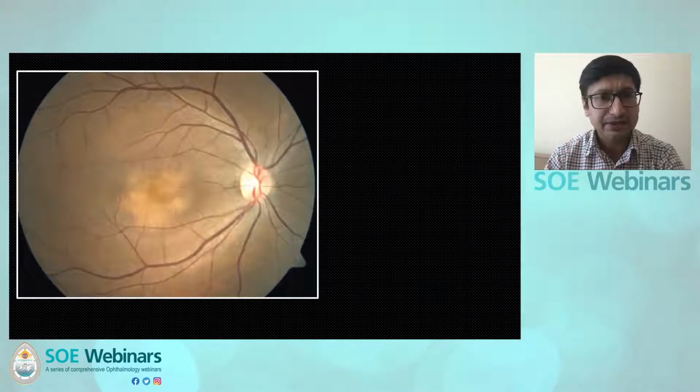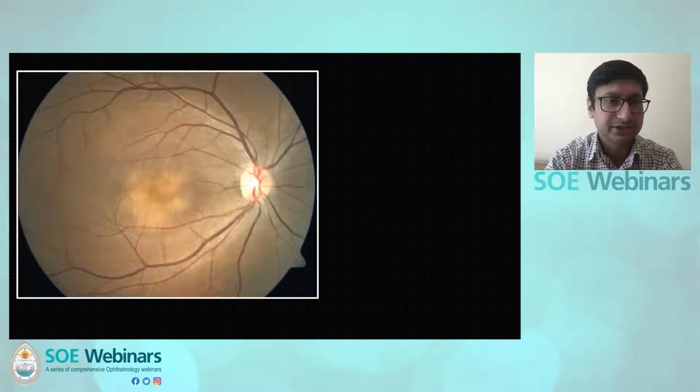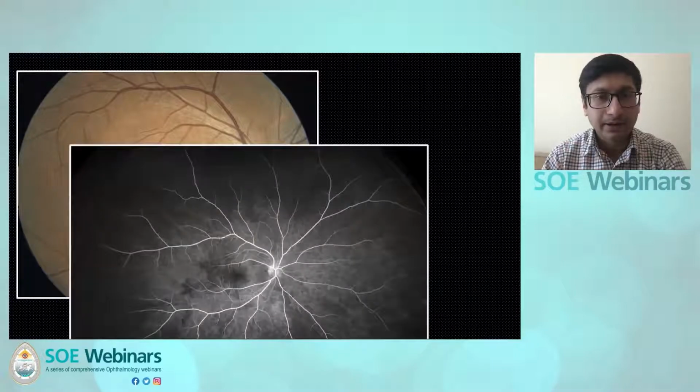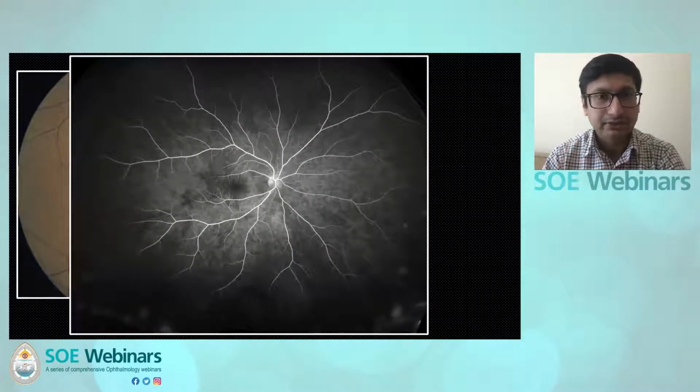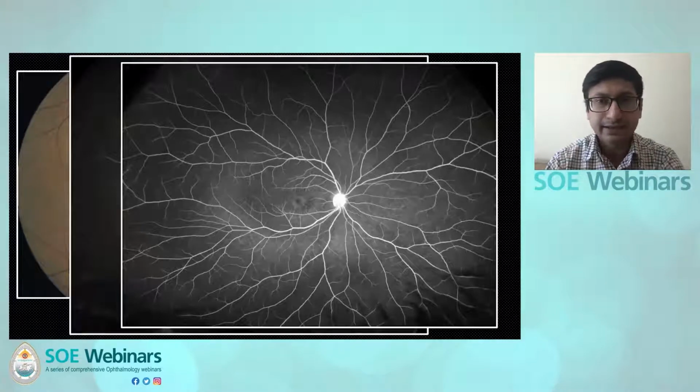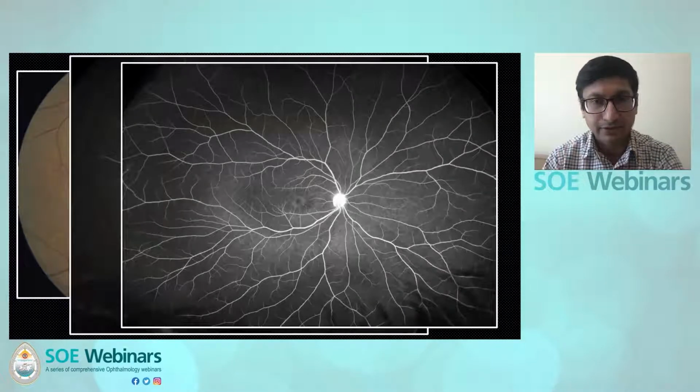And this is another patient who presents with a yellow lesion which is involving the center. You can see that there is some fluid, but it's not so much like in the previous case. The color is also not so intense yellow, it's dull. This image, the wide field fluorescein angiography, shows you some leakage in the center and the disc is mildly hyperfluorescent.